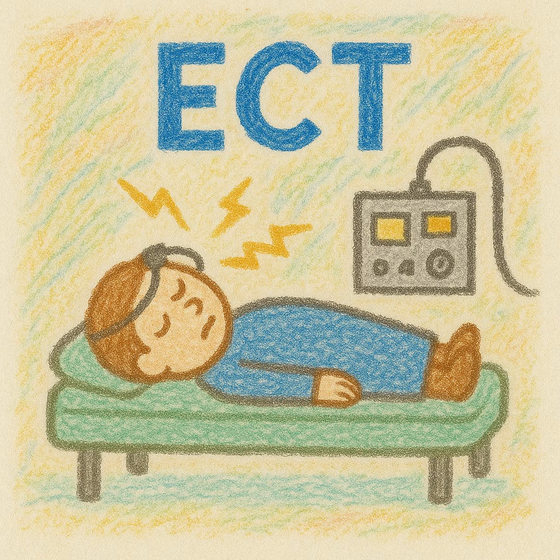Now, I want to mention how we choose the doses. How do we choose these parameters? I mentioned earlier that the device manufacturers generally have some tables and things like that, but there are basically 3 main approaches to dosing for ECT. One would be just choosing a fixed high dose. So if you've got a case of severe catatonia, you might just pick a high setting on your device. You might even just choose the maximum setting and treat them at the highest dose, because you're not really worried about cognitive side effects at that point. The person is mute and basically non-functional, so they've already got pretty profound cognitive impairments. So yeah, you might just choose a very high dose and go from there.